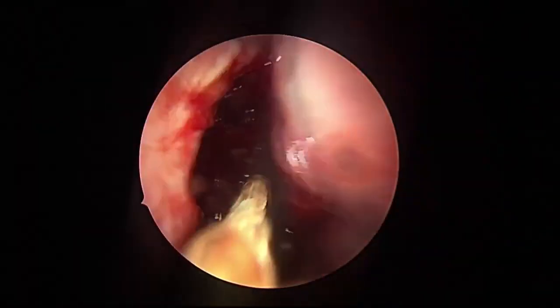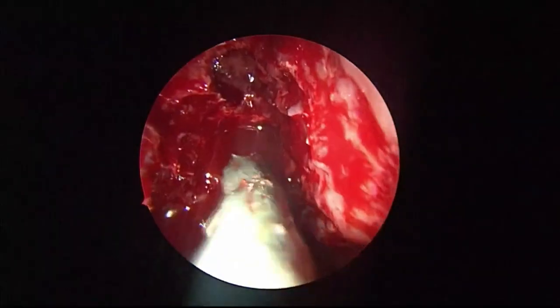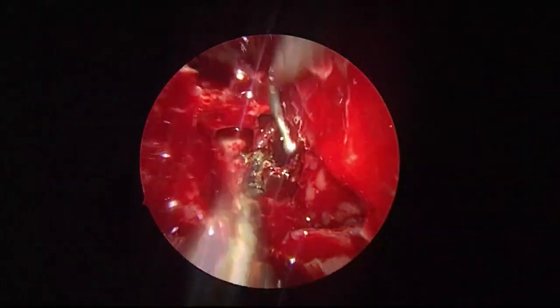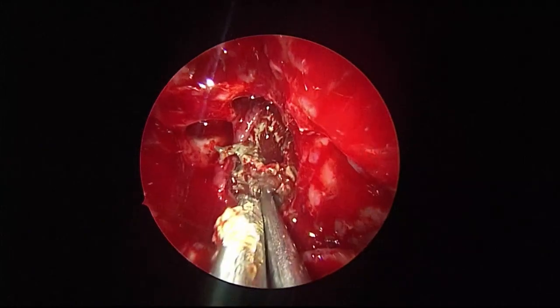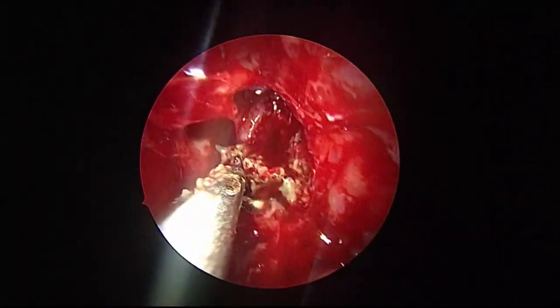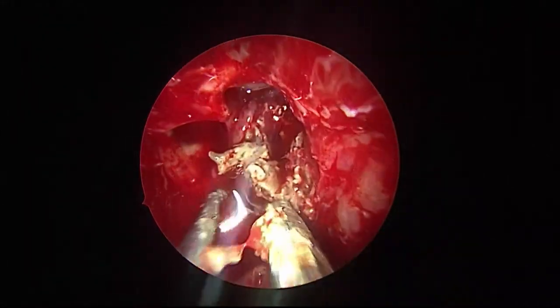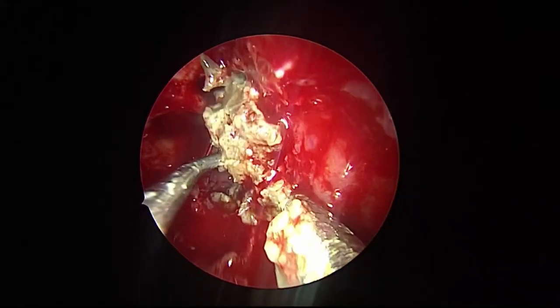Also, wash, suction. See now again. Suction, yes. Now again, we remove the chunk of it. See, the goal is to dislodge. The ball probe being a safe instrument, the direction is toward the midline.